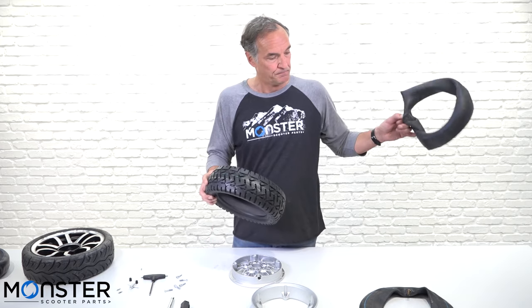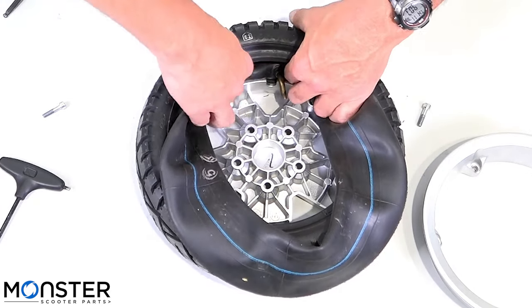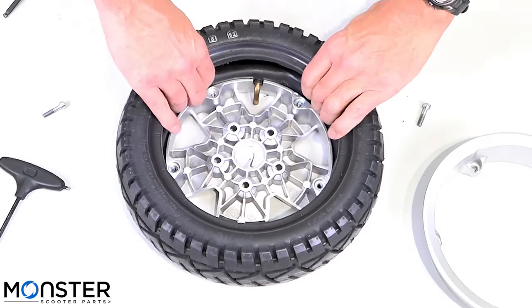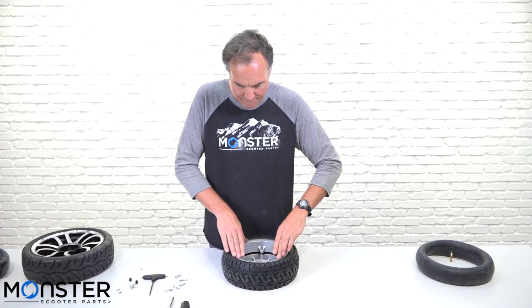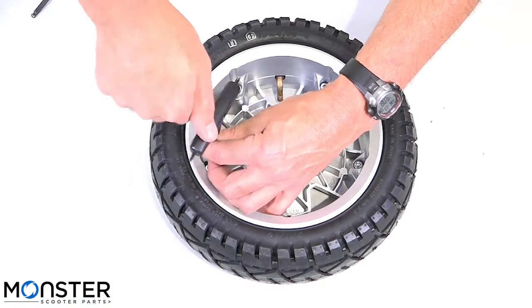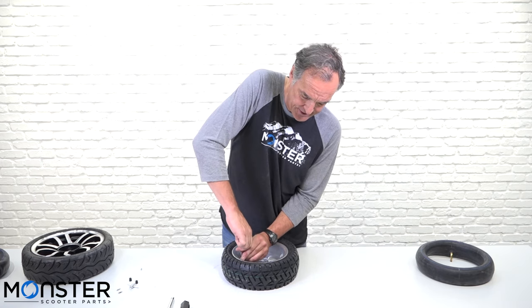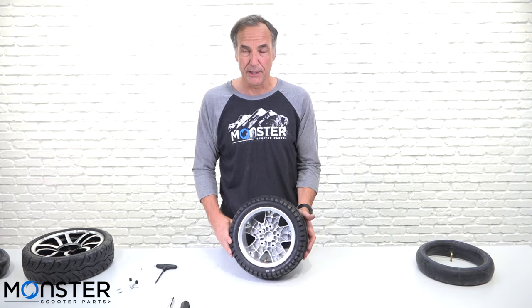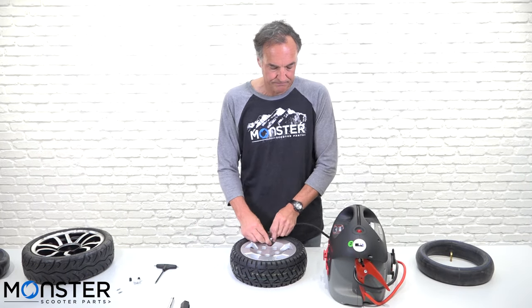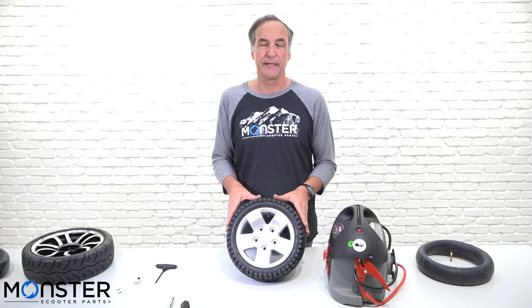Go ahead and remove the tube. Insert the new tube with the valve stem facing down. Put the rim back together, and once again tighten the bolts on opposite sides of the wheel. Once they're snug, give each one one more little turn to tighten them down a little bit more. The rim is reassembled and ready for air. Now you have your Pride Victory and Pride Pursuit XL wheel with the 3.00-8 tube reinstalled, ready to go back on your scooter.